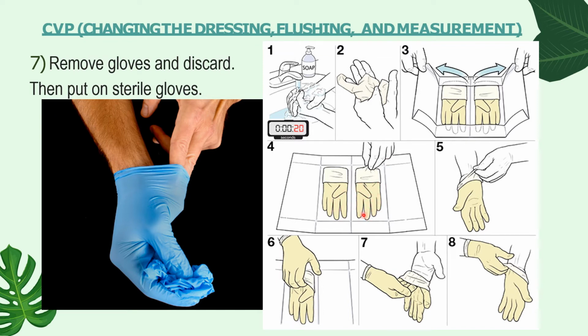sterile part. Okay, so now you wear first. Okay, using your dominant hand, you insert your non-dominant hand. Okay, and then as you can see, you are only holding the cuff of your surgical gloves. And then you can now pick the second gloves.